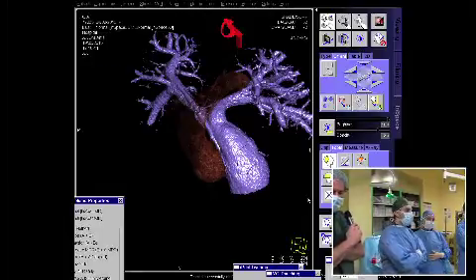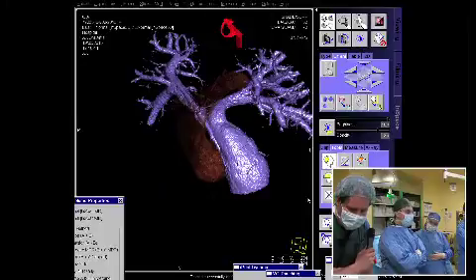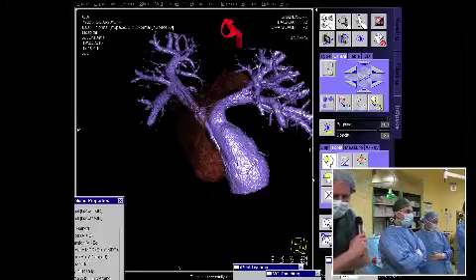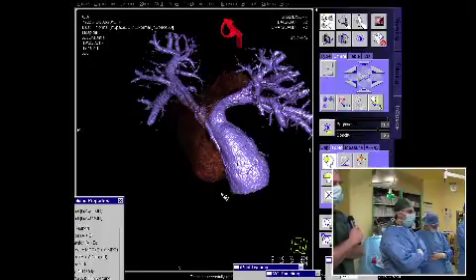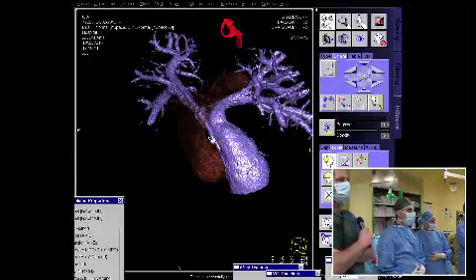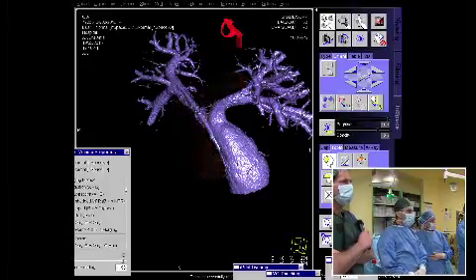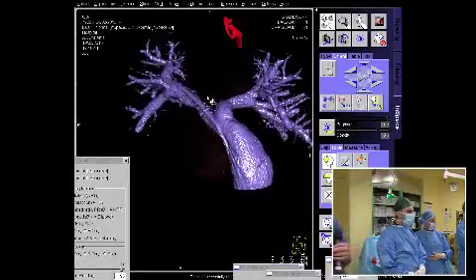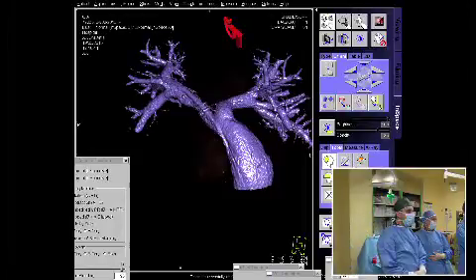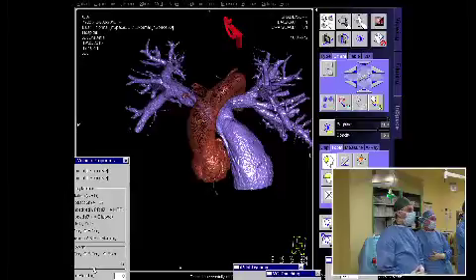Ziad and I were just talking about this. With isolated RPA branch stenosis, to have systemic pressure is very unusual. And there's mild kinking if you look at the proximal origin of the left, and how the left goes up and tilts. So we were just talking about someone with systemic pressure. It'd be just like what was done with the breaking stents that was in the earlier talk, could be in the Valeo. It would be a perfectly good case where you would stent the RPA and extend it and cross the LPA, and then go through the open cell design and fix the LPA. An isolated RPA with systemic pressure shouldn't be.